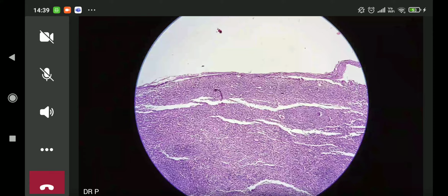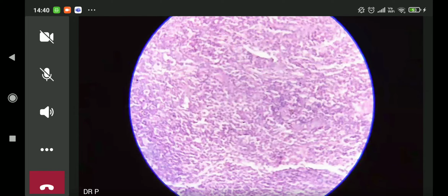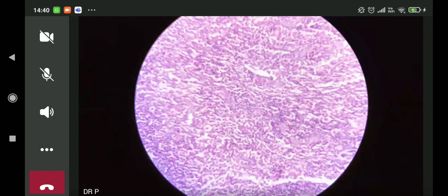Now, in the lymphoid follicles, had it been the spleen, you would have seen something else. And what is that something else? So in the lymphoid follicles, now you can see the various lymphocytes over here, but in the spleen, you would see a large eccentrically placed arteriole, okay? So that is missing in all the lymphoid follicles in this section.